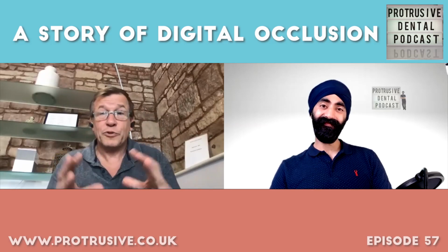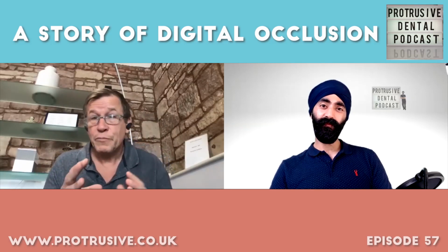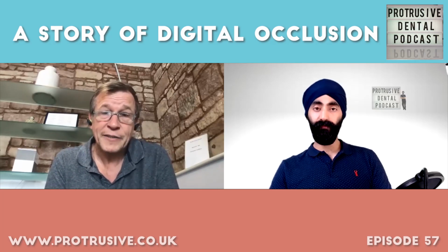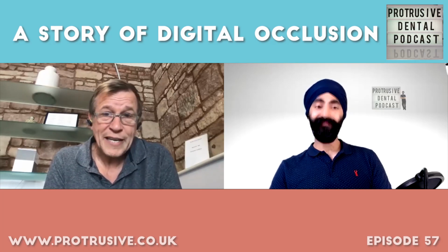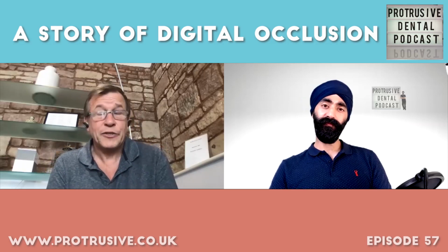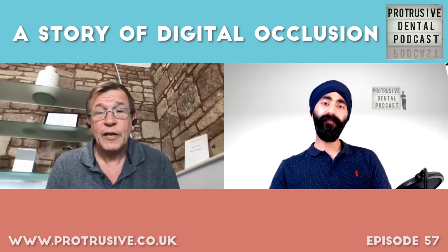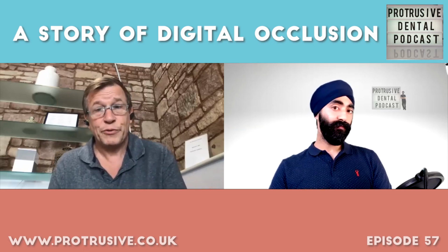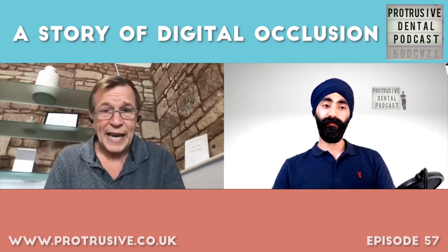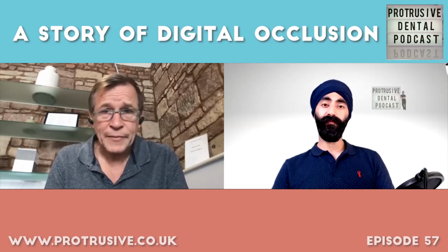Digital orthodontics was coming on, so we could actually start to move teeth and see how these would look, which was again a deal better than sawing teeth out and doing Kessling setups the way we used to. In-house restorations was going real well. Also, the fact that I could work with a lab was great, because I could scan a patient and they had the information in seconds rather than 3 days.